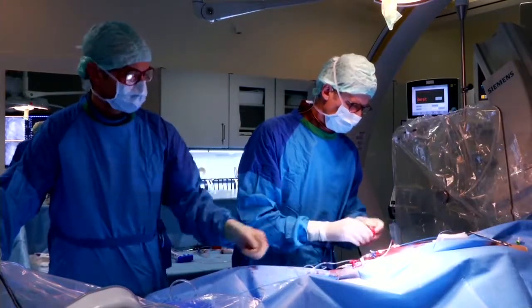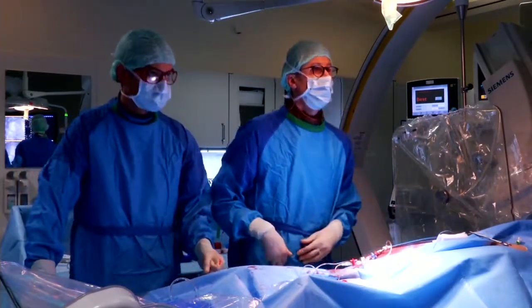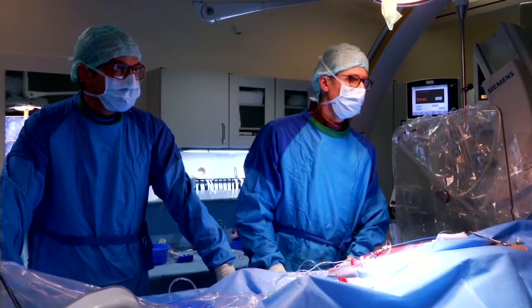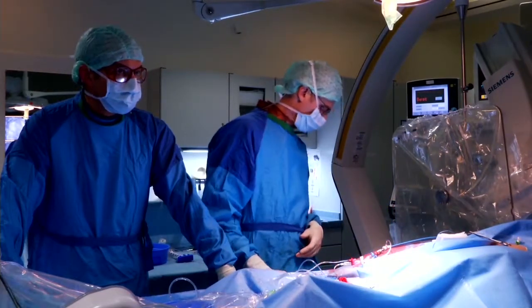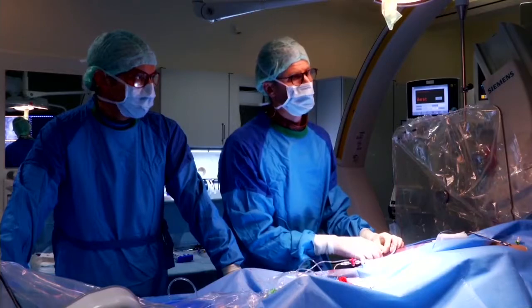Well, I think we do it both. We are not dogmatic about that, and it worked fine. The wire went there. When I look at the anatomy of the arch, I felt comfortable. The aortic valve gave a lot of support, and therefore I just did it this way. But I'm quite confident that you can do it in the truncus as well, or in another place.